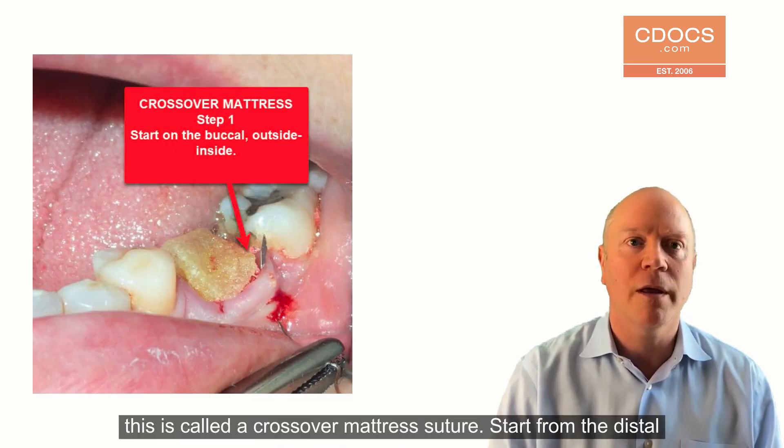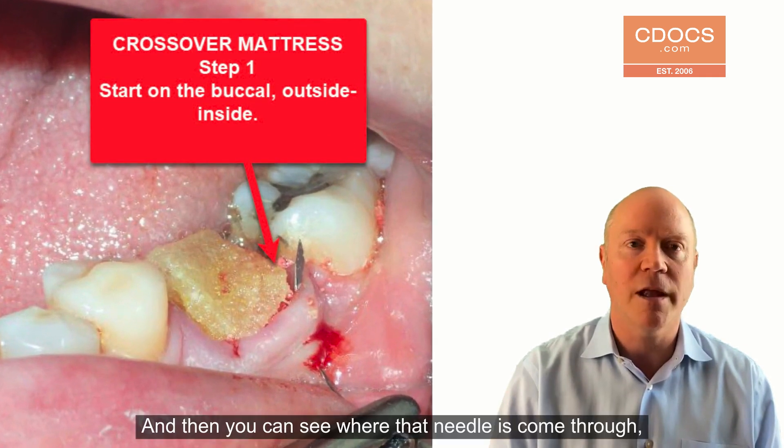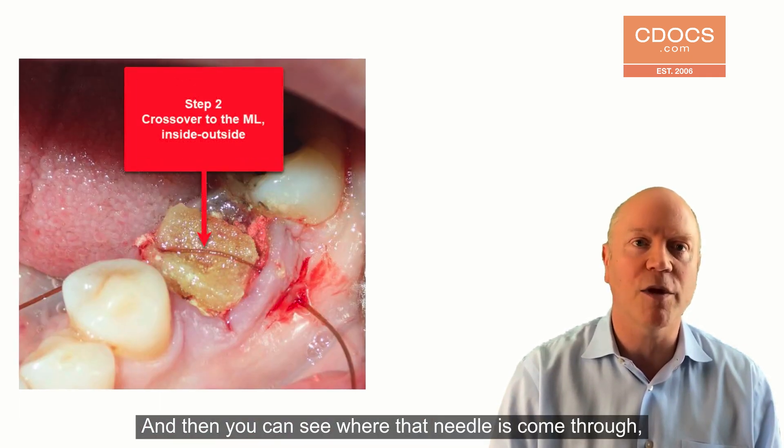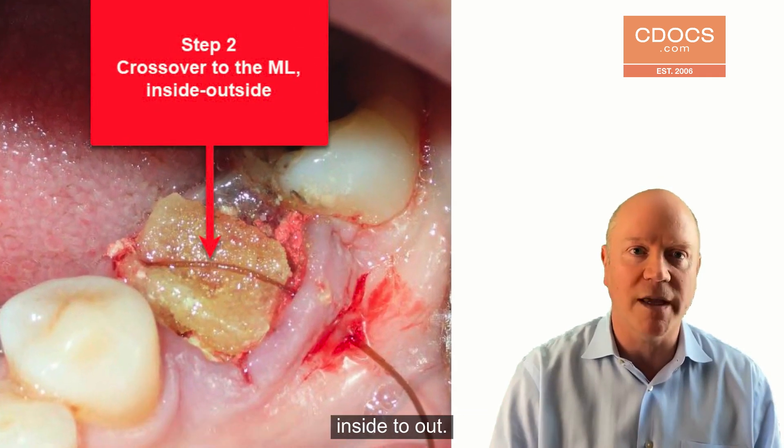To start the suture, this is called a crossover mattress suture. You start from the distal buccal — you go outside to in. And then you can see where that needle has come through. You bring it over and cross it over to the mesial buccal. You go inside to out.